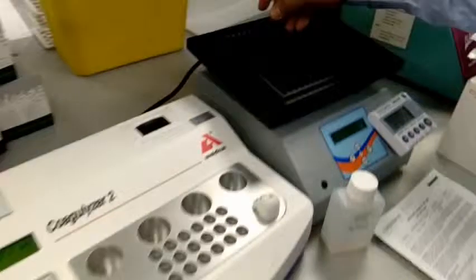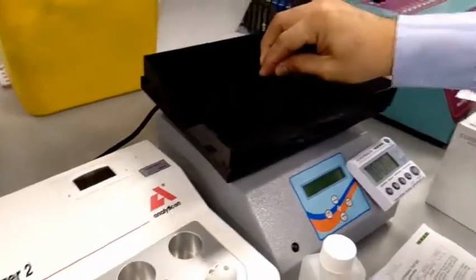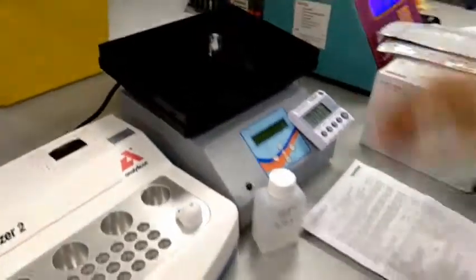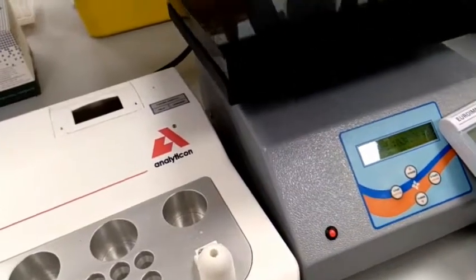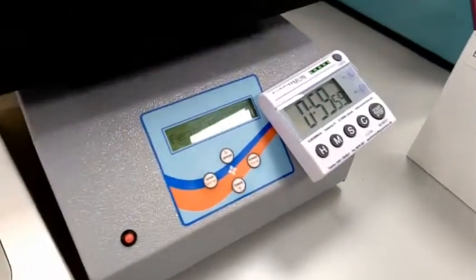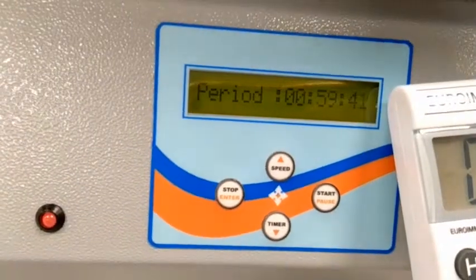You have to put it here, and then you have to come back. One hour. One hour. You can try it on yourself — how to set the time.